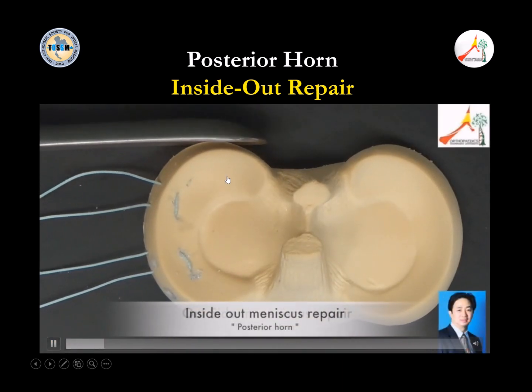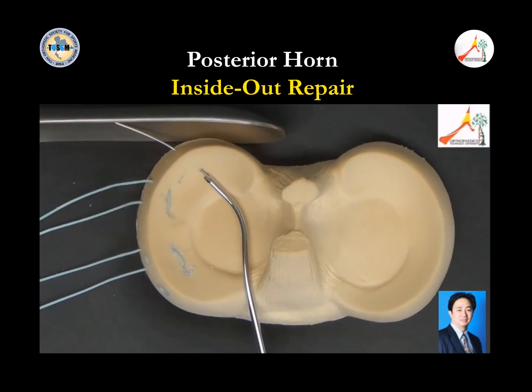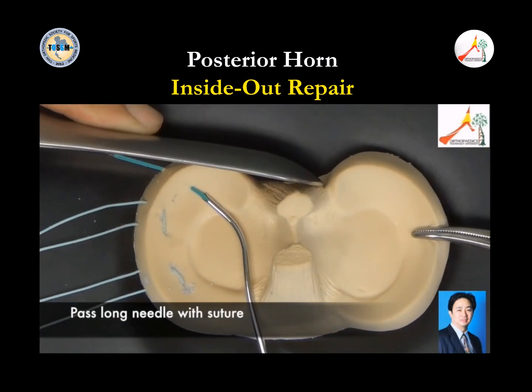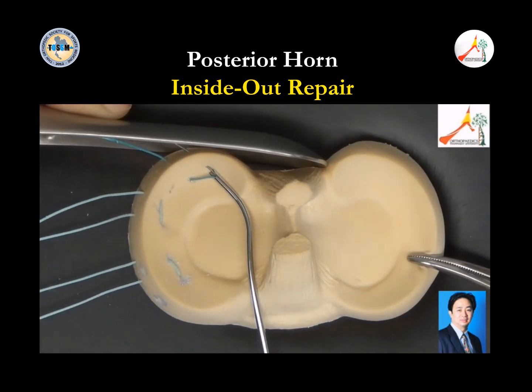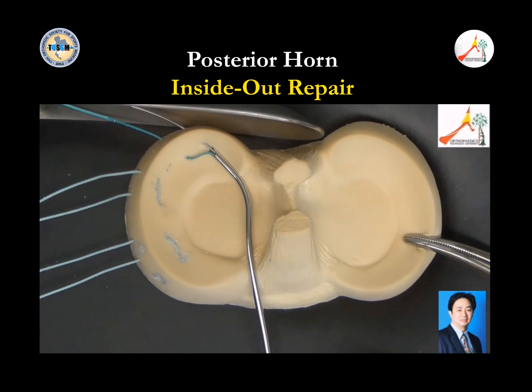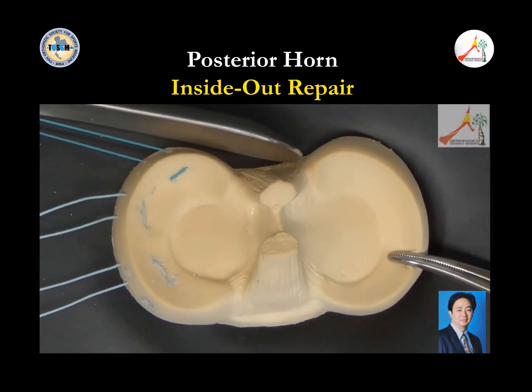You can make a small incision and put the protector. We always put the spoon in the back of the joint, to protect the vital structure in the back. Do it this way. So actually you can come from nearly every zone of the meniscus repair.